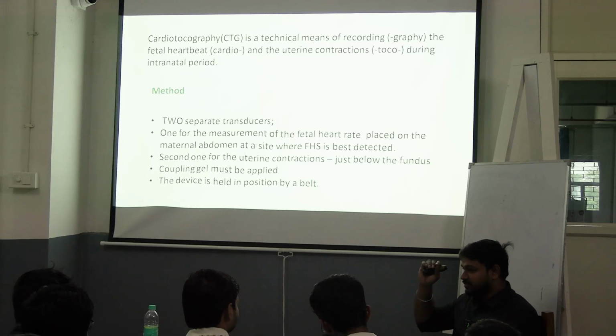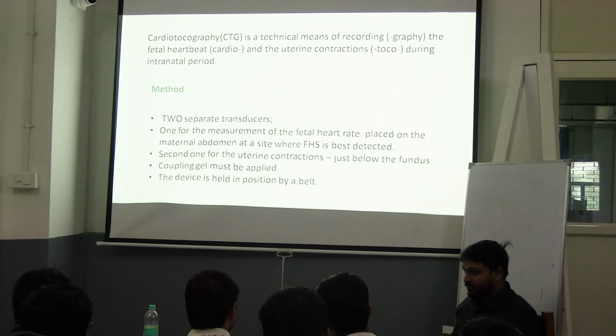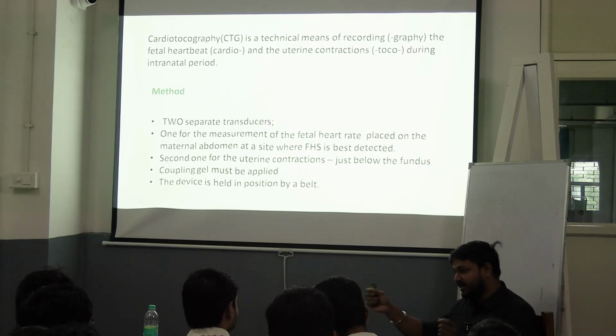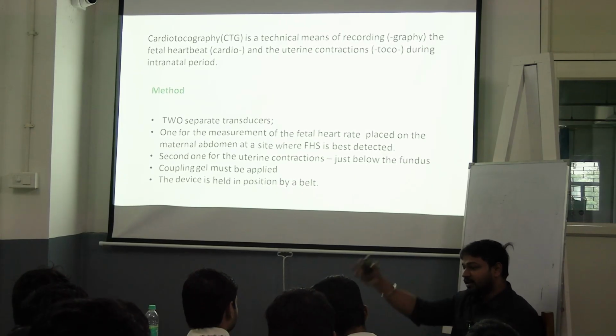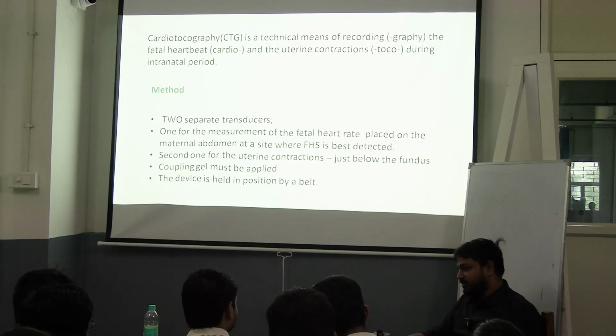It is mostly on the midpoint of the left spino-umbilical line. There we try to position it and we will hear the fetal heartbeat. Then we will tie it. And then the other one on the fundus to record the uterine contraction.